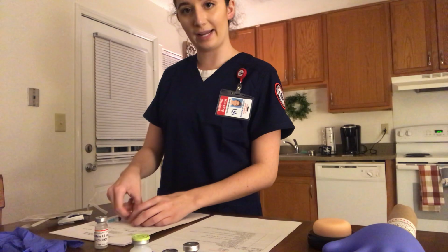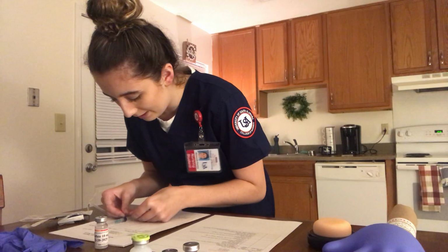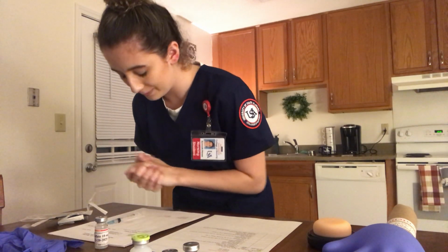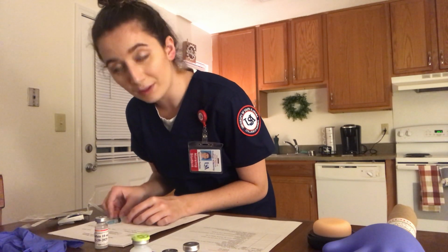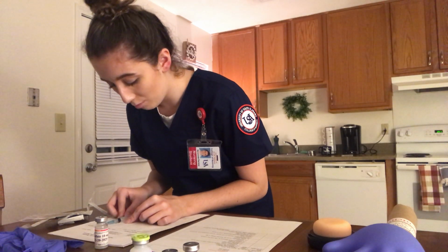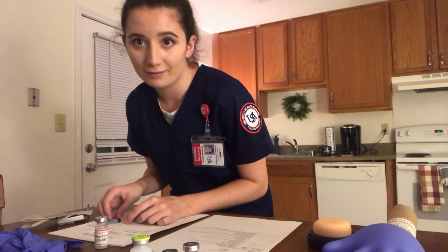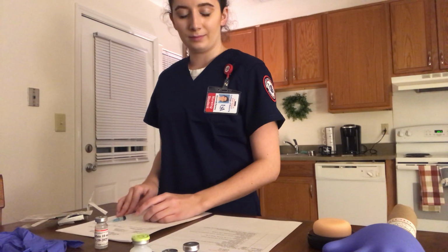I will then prepare a sticker that I will put on my now filled medication syringe. It has my patient's name on it, the name of the drug, and the dosage. So it says Jaguar Jones, morphine sulfate, 5 milligrams or 1/2 milliliter. I would then go to my patient's room.